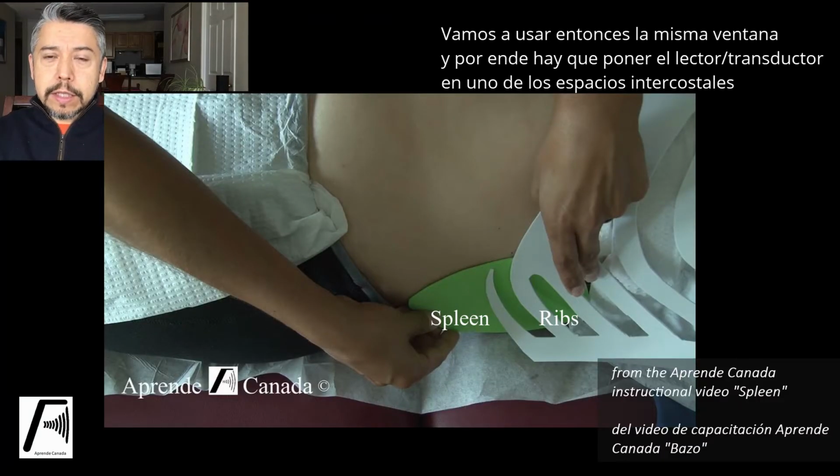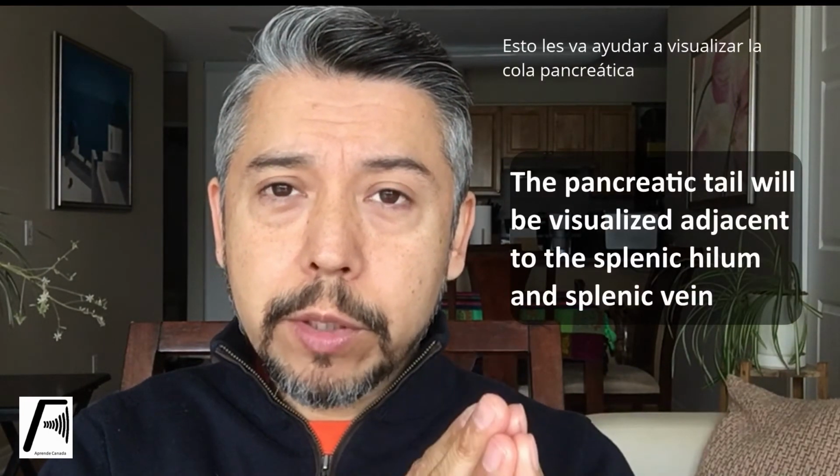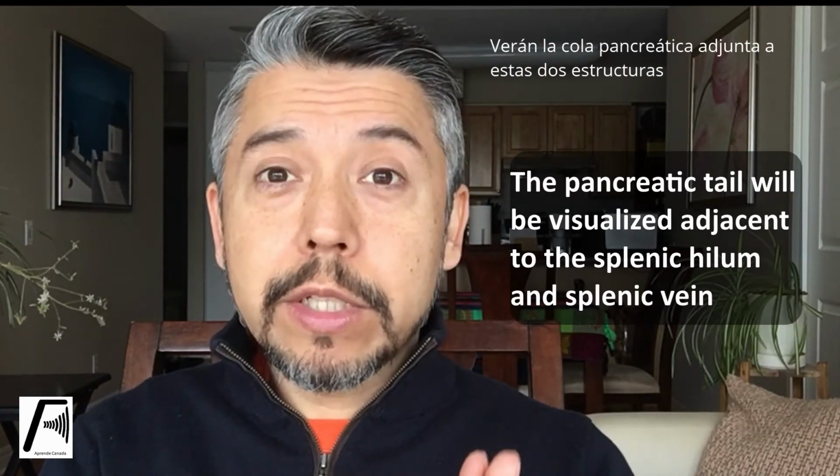So we're going to be using the same window. You place a probe there, intercostal, of course, so make sure you are in between the two rib shadows. And then you're going to be looking for the hilum and the splenic vein, either one, and that should help you find the tail. So the tail will be pretty much adjacent to those two structures.